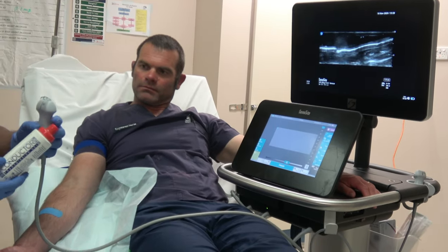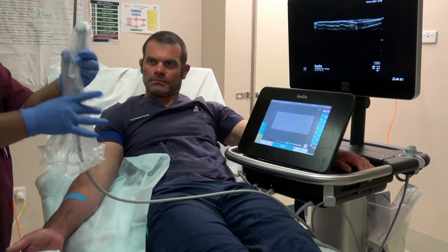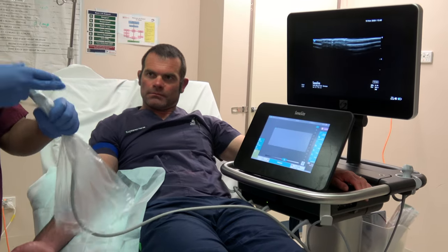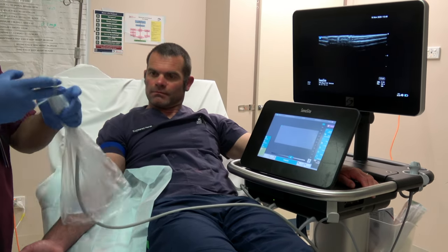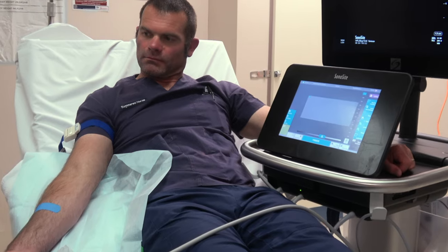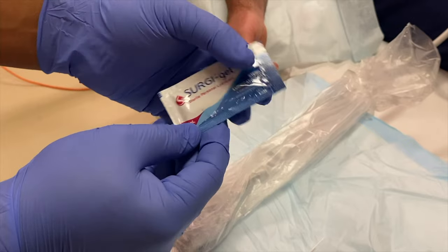Next, apply the probe cover. Use a mixture of 2% chlorhexidine and 70% alcohol to prepare the skin, then apply the probe cover for further steps.